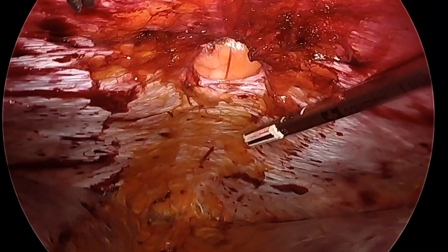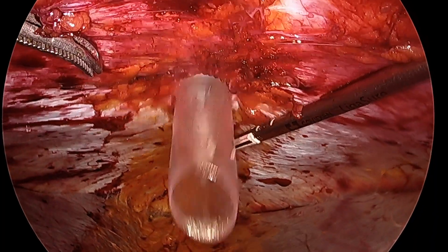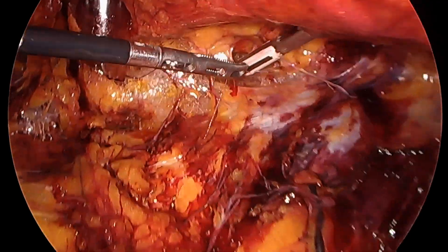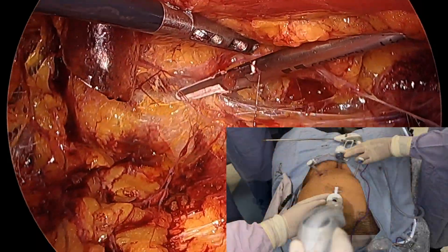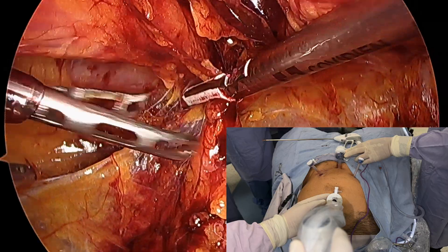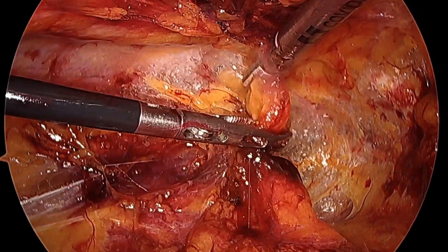Finally, you can see the hernia defect and the diastasis. Through this hernia defect, we're going to place a 12-millimeter port and insert the vision through this port, now looking downwards into the inguinal areas. Our left hand becomes the right hand and the right hand becomes the left hand, and we do an ETEP for the inguinal hernias. This patient had two rather small direct hernias and big cord lipomas in both inguinal areas.